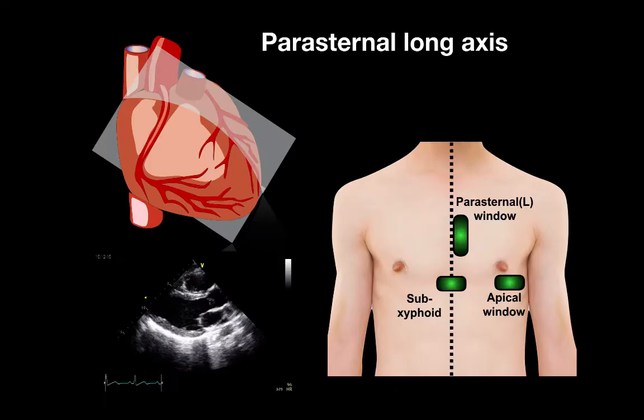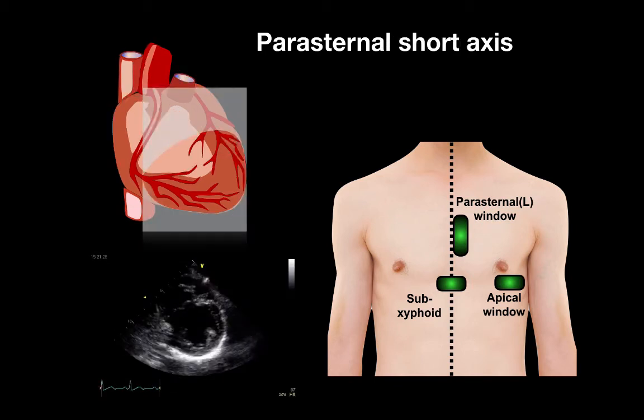The parasternal long axis image acquisition is a touch different because again it refers mostly to the anatomical position and to the axis of the left ventricle. The parasternal short axis really refers again to the parasternal placement of the probe, but also the short axis of the left ventricle. The short axis acquisition technique really falls very closely to the parasagittal plane.